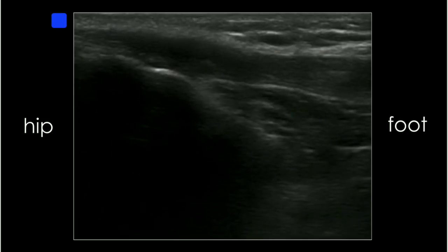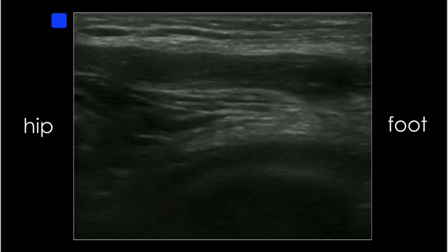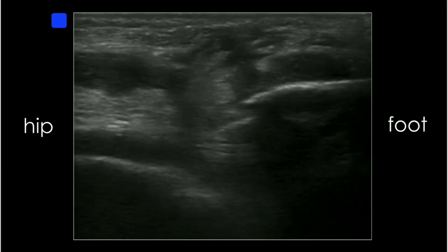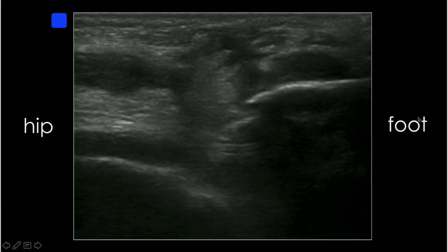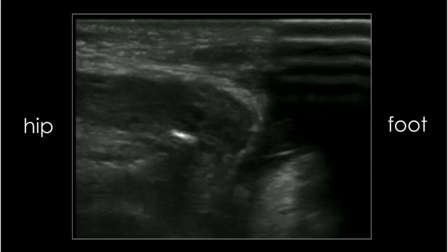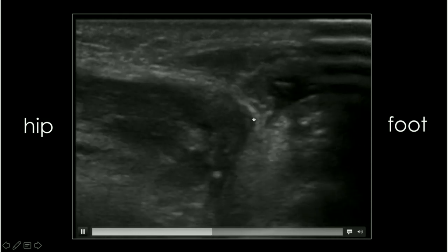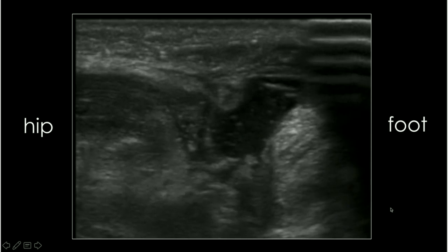Then if you go ahead and advance your slide, you'll see that we've picked up the tendon and we start moving towards the foot, and we see the tendon, and then whoops, something's wrong right there. So go ahead and advance that slide for me. What you'll see here is we're actually passively extending the lower leg, and we can literally pull apart the two pieces of the tendon.